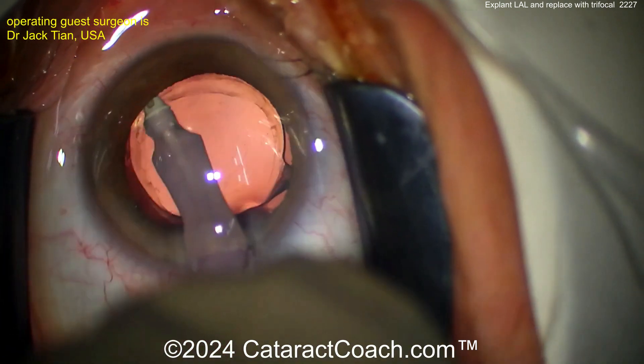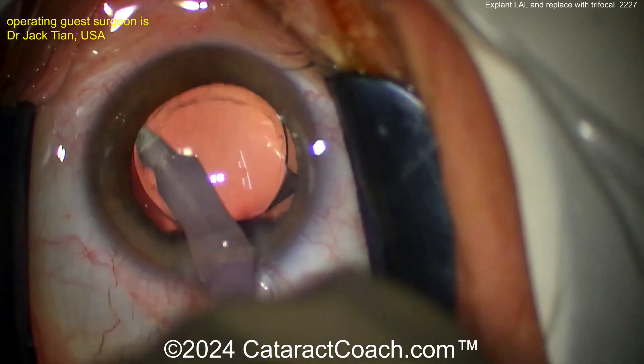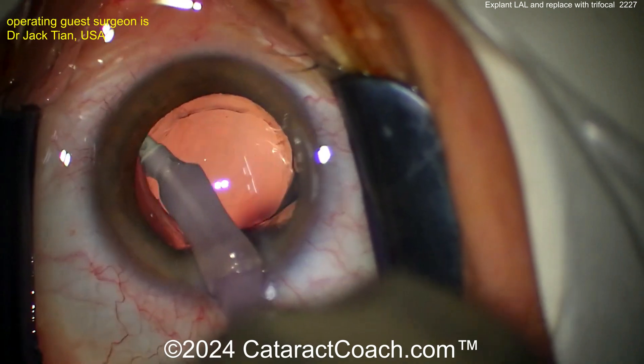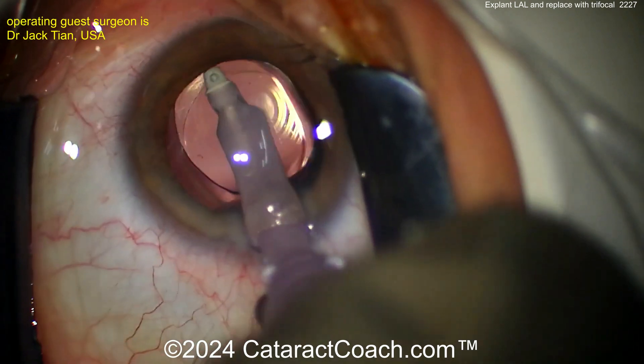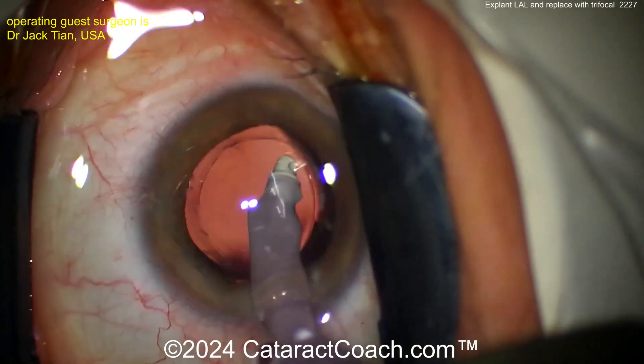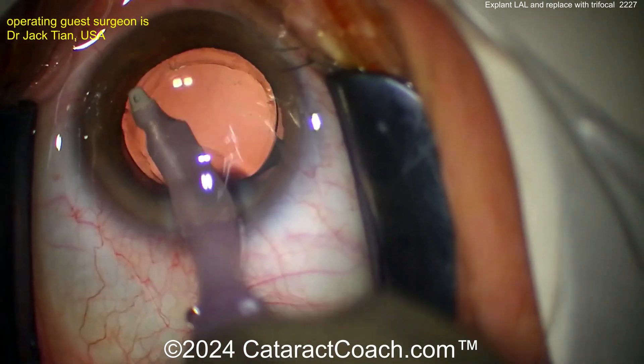But if you get those photons at the back of the eye and put them all at one focal point — like with a monofocal lens — that'll give you less range but higher quality vision. With a trifocal in the eye, those same photons are split among a wider range, but the quality of vision may not be quite as good. So again, it's all about setting appropriate patient expectations.